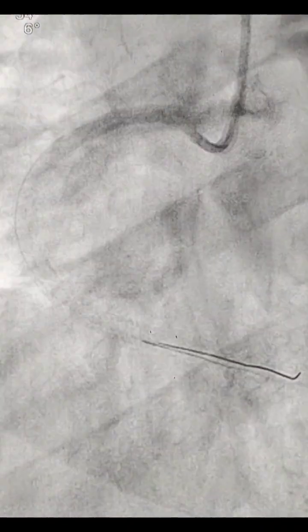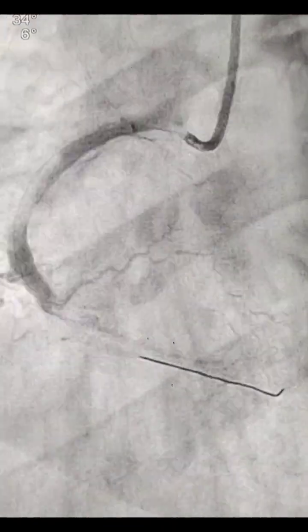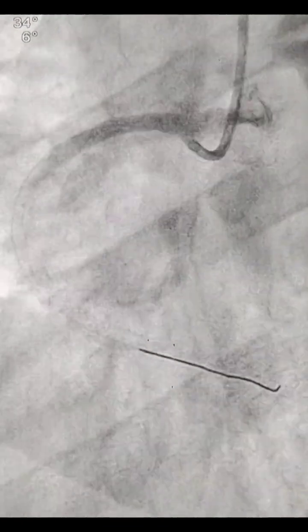So the next option is probably aspiration, thrombosuction, or before that you can try balloon daughtering. So this is balloon daughtering I tried with a simple 2 into 10 balloon. Balloon daughtering is using an uninflated balloon. You can do the to and fro motion of the balloon so that the path may get cleared. After 2-3 attempts of balloon daughtering, there's nothing. The flow has not come.